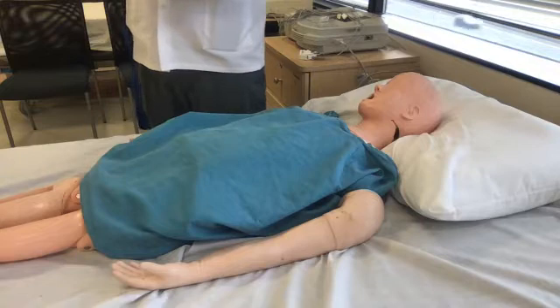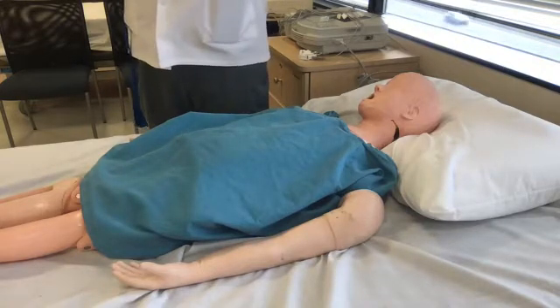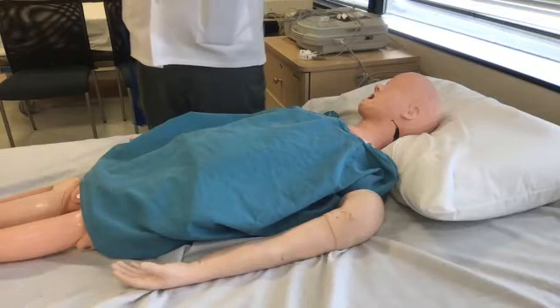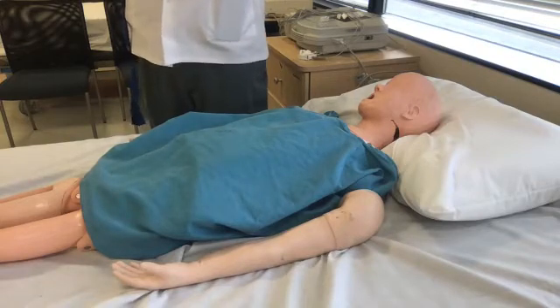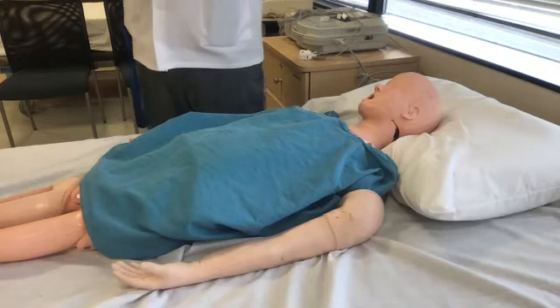So if you have an abnormal reading, right? Don't stick the results out where everyone can see, but enough to see the name pop up, and that's a signal to the doctor or the nurse or whoever's going to be looking at that, "Hey, this is something important."